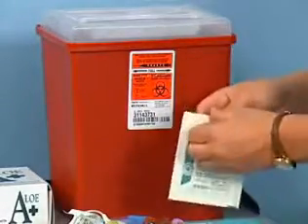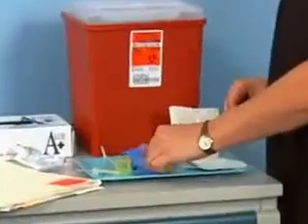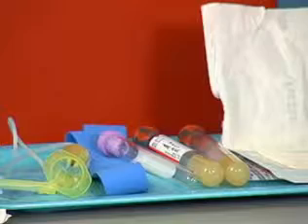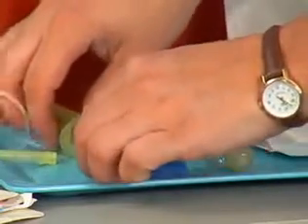Open the sterile gauze pack and lie it flat to allow the gauze pad to rest on the inside of its wrapper. Position the evacuated tubes in the correct order of draw. The serum separator tubes must be drawn first, followed by the lavender tube. Pick up the first serum separator tube and place it loosely in the plastic holder.